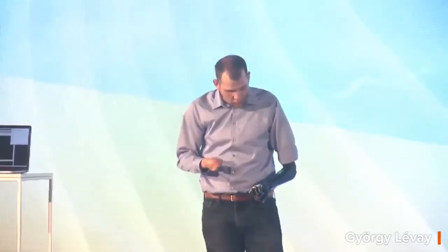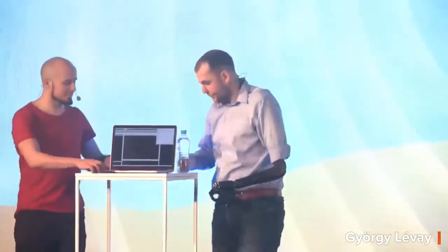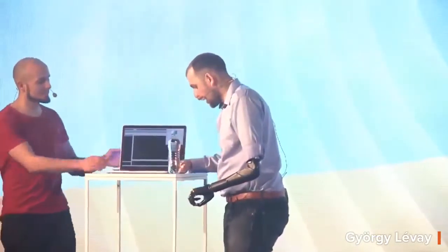Now, I don't know that with this. The only feedback I have from it is looking at it. There's some sound, but I can't really map that efficiently to anything. So when I try to pick something up, for instance, let's say this bottle of water, which is neatly tucked away behind the laptop, I have the same difficulties as you're going to have trying to pick it up for me. So let's try and do that.